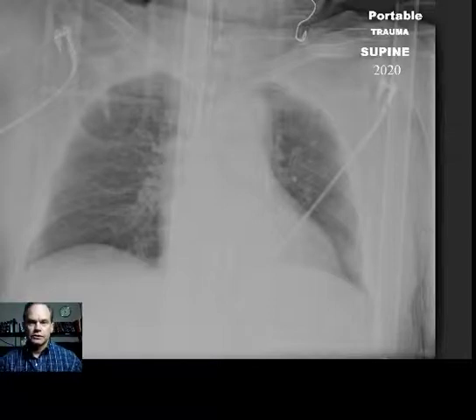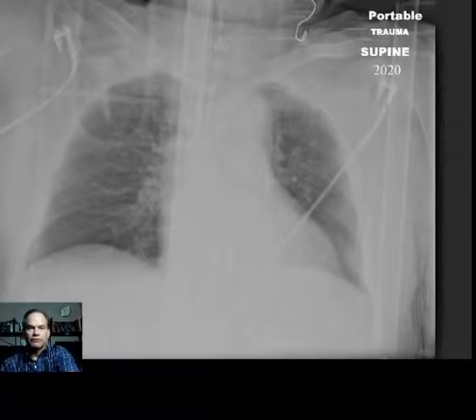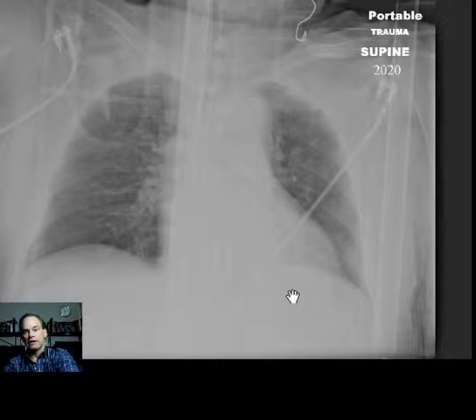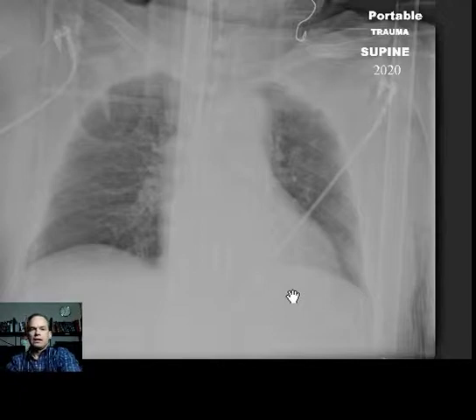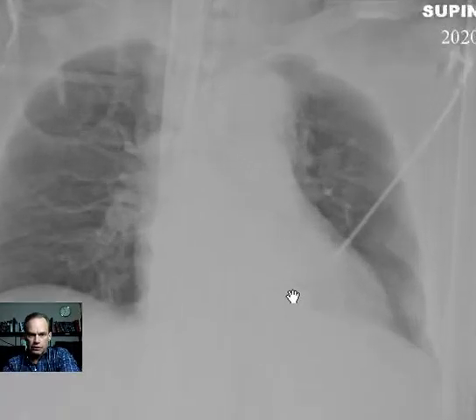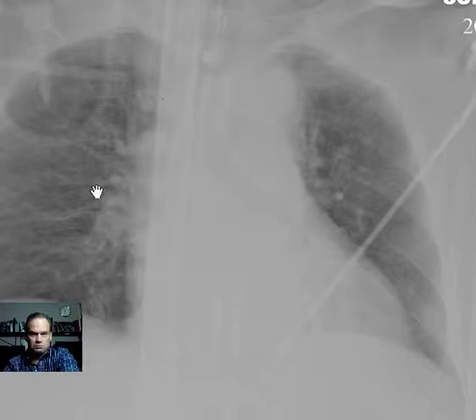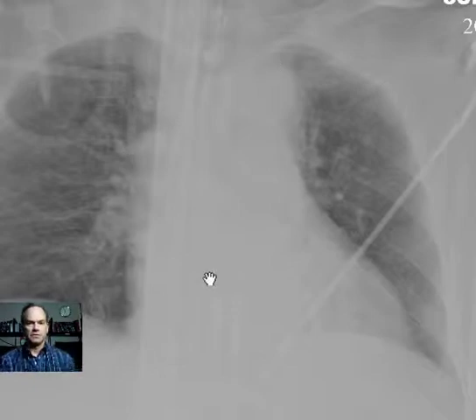Hello, this is Dr. Mintz. This is a fairly straightforward case designed to give you a better sense, a better intuition about atelectasis. Atelectasis simply means volume loss. If you look at this chest radiograph, do you see anything abnormal? Not really, nothing very striking.